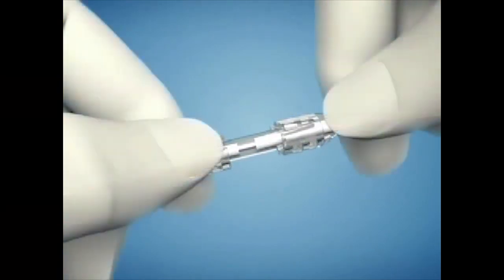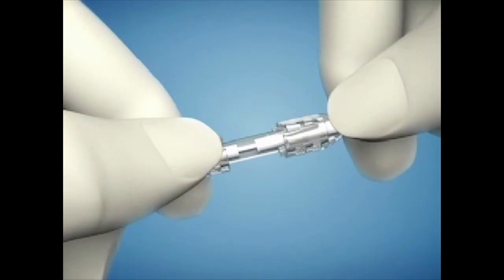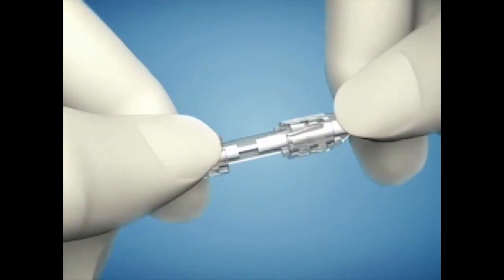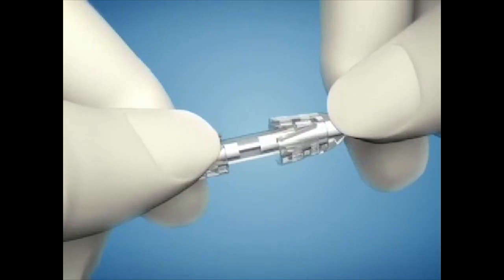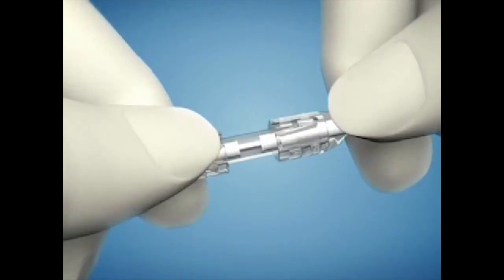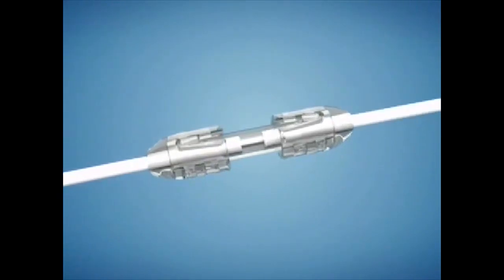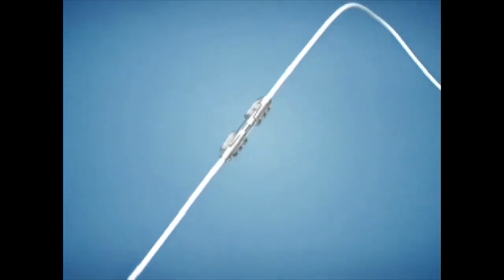Firmly grasp the collet that is over the pump segment, and with the fingers of the other hand, grasp the tapered portion of the collet that is over the inserted spinal segment. Push the spinal segment collet towards the center of the catheter connector until you hear and feel the collet click into place. Maintain a firm hold on the collet that is over the pump segment and tug on the spinal segment to check that it is firmly attached to the catheter connector.